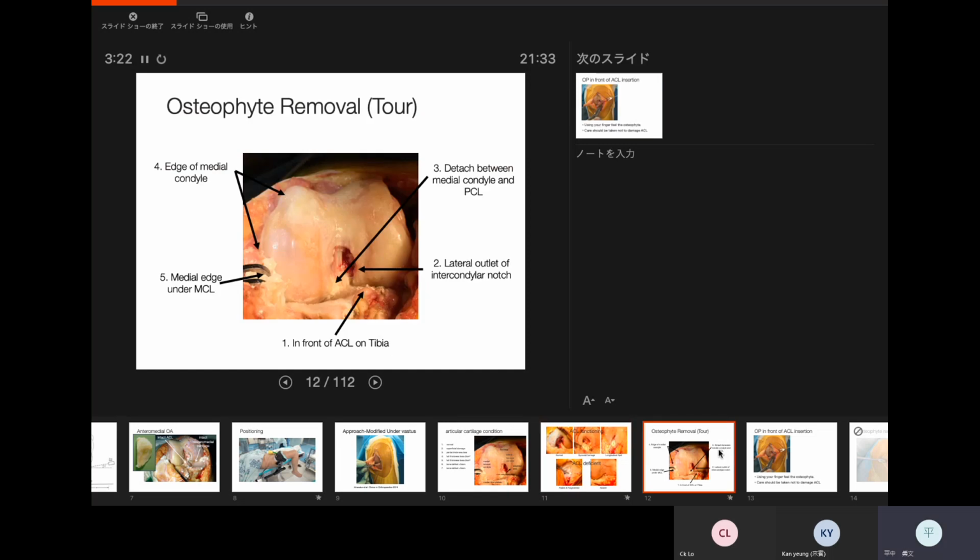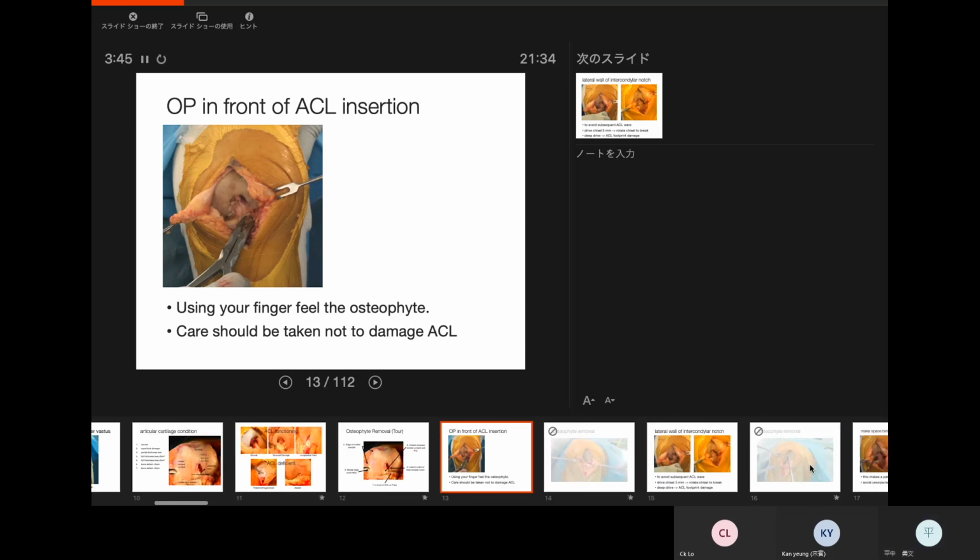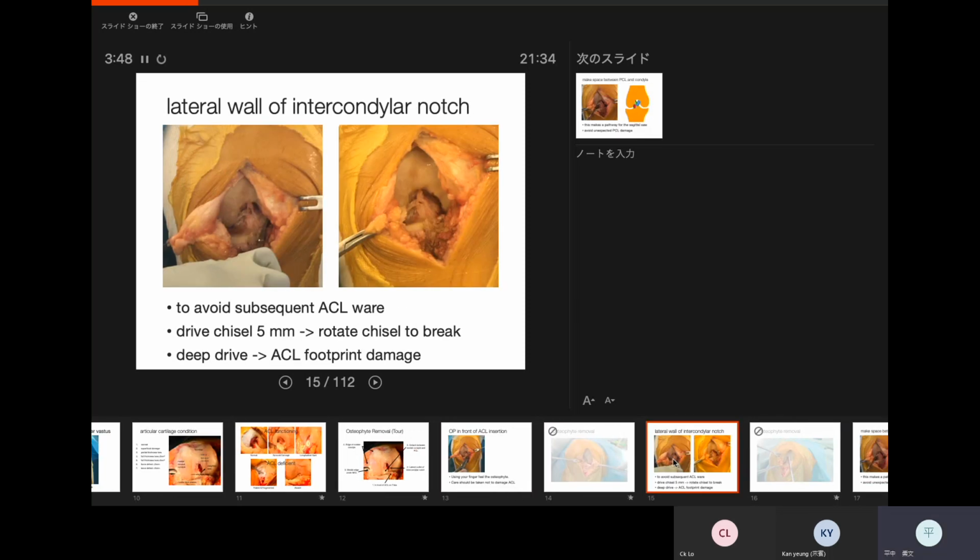Then first we should do the osteophyte removal. The first is to remove the osteophyte in front of the ACL insertion on the tibial side. That can prevent full extension. So after the removal of the osteophyte, it mostly can extend fully. Next, remove the osteophyte at the lateral edge of the intercondylar notch that can hurt the ACL in the future, to prevent subsequent ACL damage. You should remove it and make a big space for the future ACL.